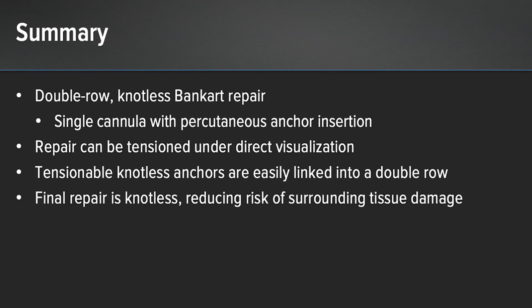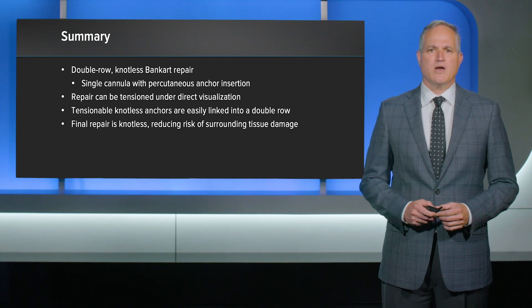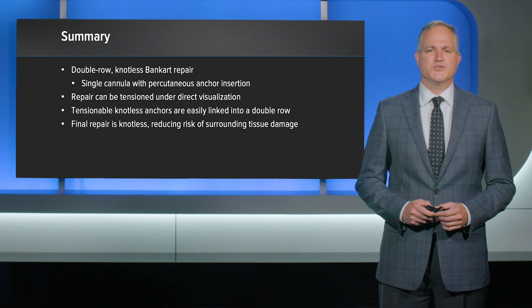In summary, a double row knotless Bankart repair can be accomplished with a percutaneous anchor insertion and a single anterior working portal. After both anchors are inserted, the repairs can be tensioned under direct visualization. The tensionable knotless anchors are easily linked into a double row, which provides improved bone-to-bone contact by applying compression between each anchor location. The final repair is knotless, reducing the risk of surrounding soft tissue damage.